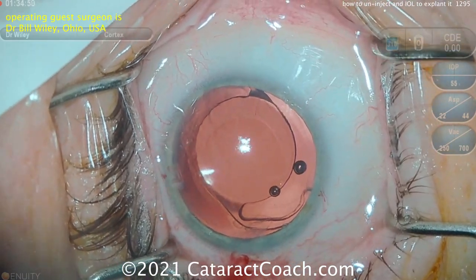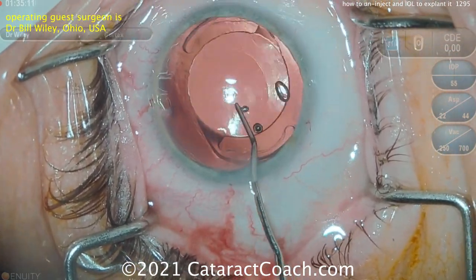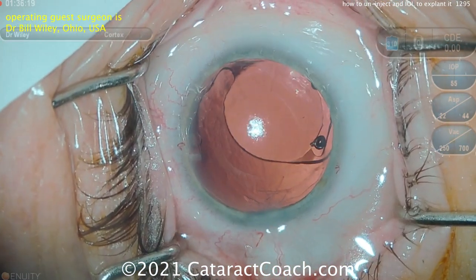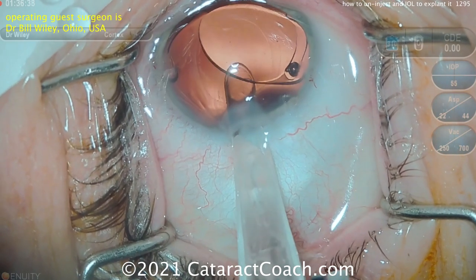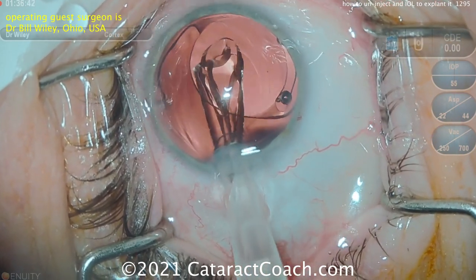He's going to carefully dissect the old lens out of the capsular bag using plenty of viscoelastic and bring it up into the anterior chamber. More viscoelastic is used to further expand the capsular bag, and now the new IOL will be placed in the capsular bag first — a smart way to protect the posterior capsule.